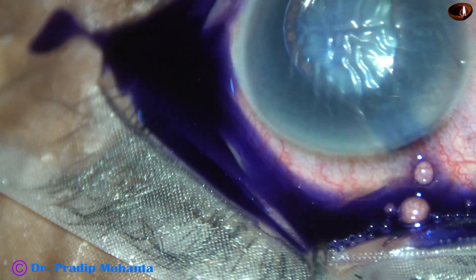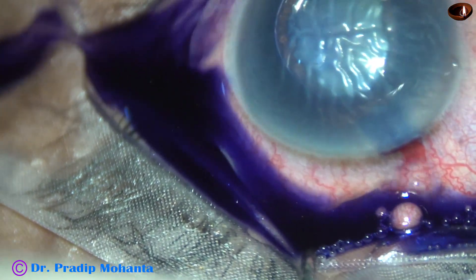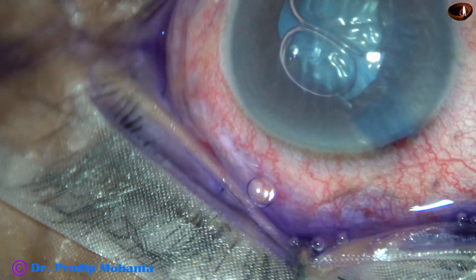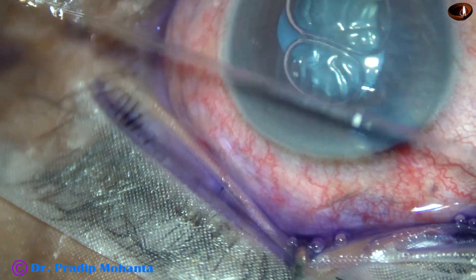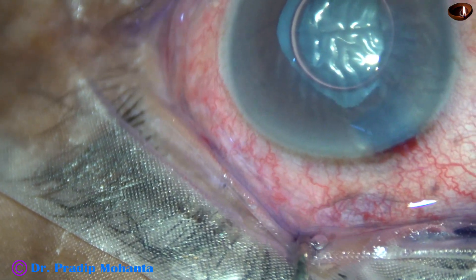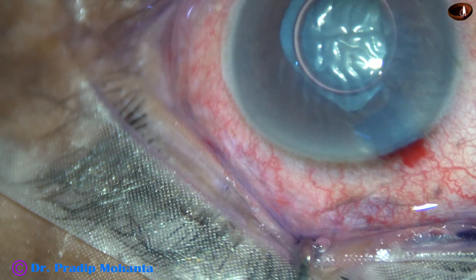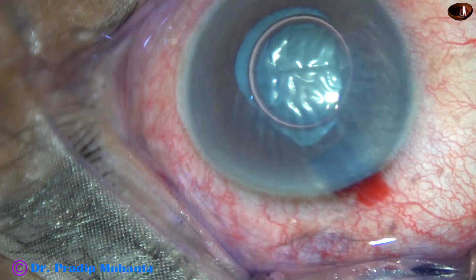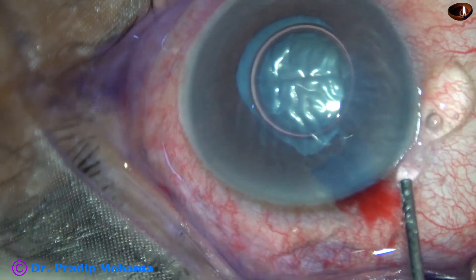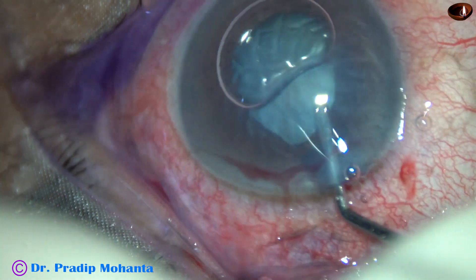The main incision has been placed. This is trypan blue dye to stain the anterior capsule. A little bit of adrenaline was administered. And now the anterior chamber is being filled up with 2% hydroxypropylmethylcellulose.